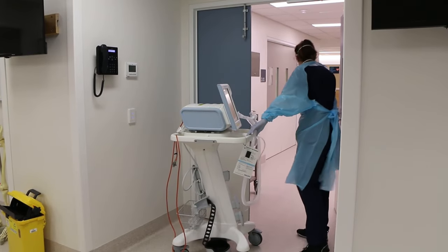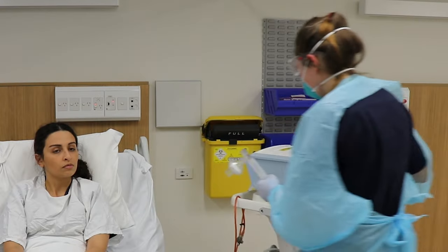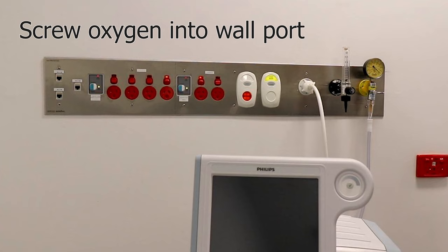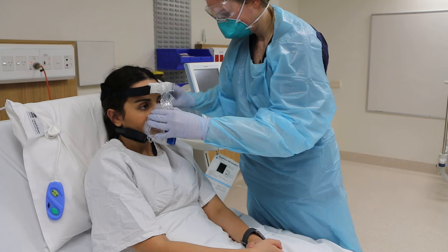Enter the patient's room wearing appropriate PPE and plug the machine into the power point closest to the entry door. Connect the high pressure oxygen hose to the oxygen port on the wall. Mask fitting is to be done with the machine turned off.